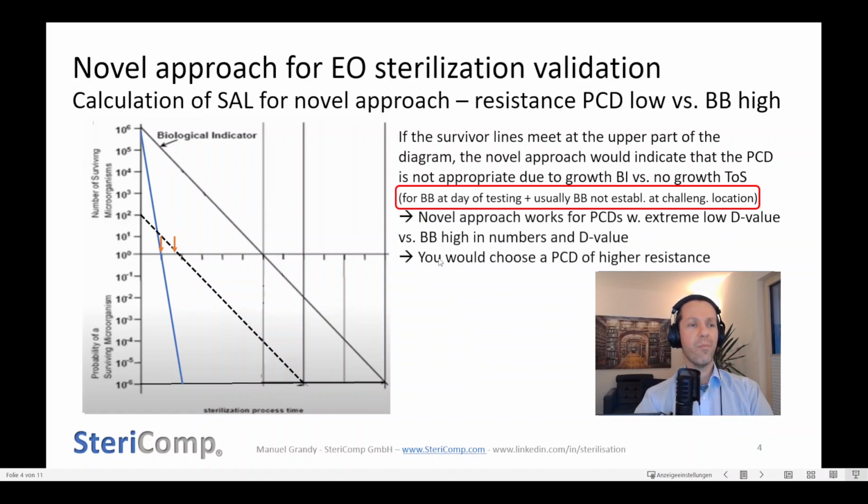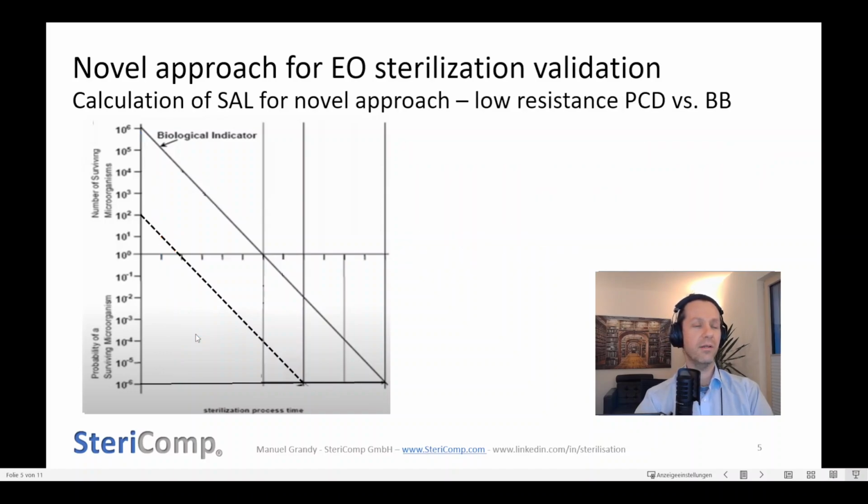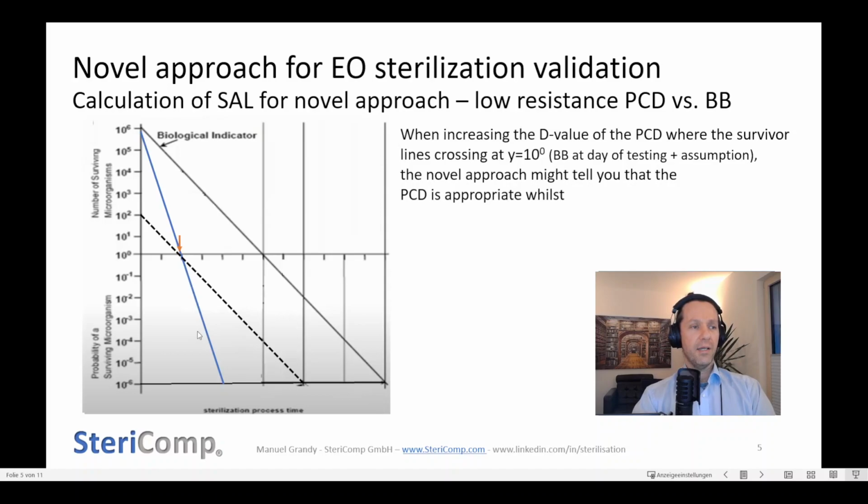And now you would choose a PCD of higher resistance, okay? And let's say a more realistic one also. And here the approach is getting into trouble.